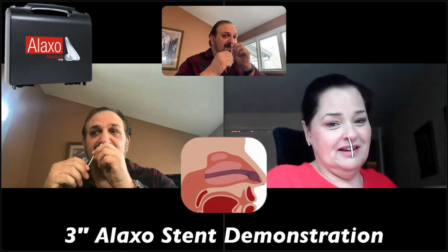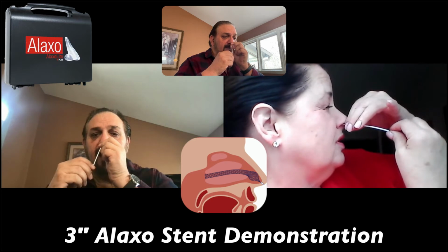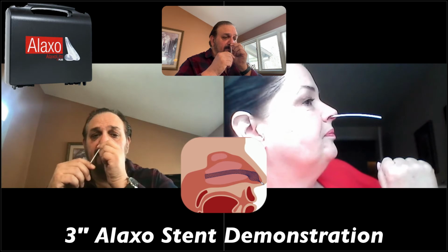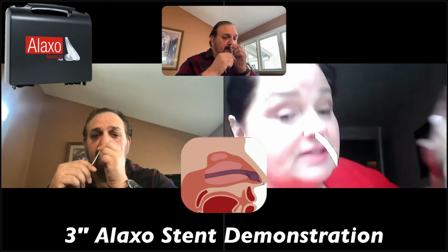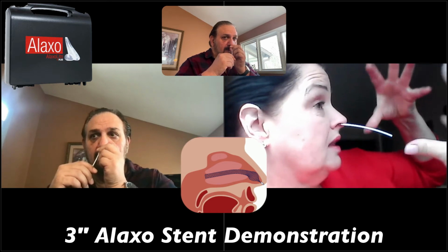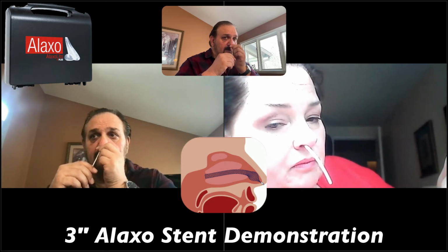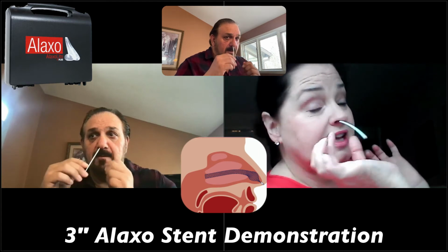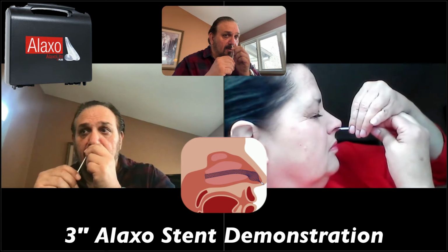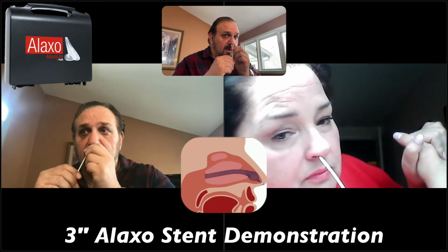Okay. So now you're going to take the top rod, which is the pusher. I see. So I pulled on this thing down here. Right, you do want to keep that static. This clear plastic thing up here is covering it and keeping it closed up. So when you pull that back, it will expand and open. You actually have to press up on the white thing so it doesn't come down. Yeah, I find you need to stabilize the pusher rod a little bit, and then you can pull down the clear thing, because otherwise the white one will come down as well.